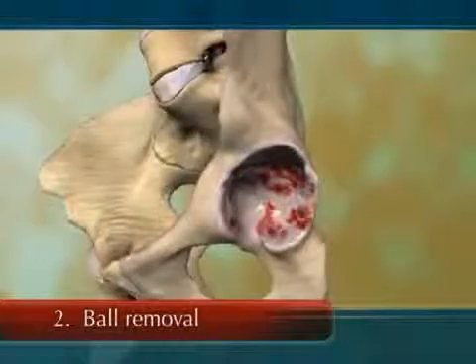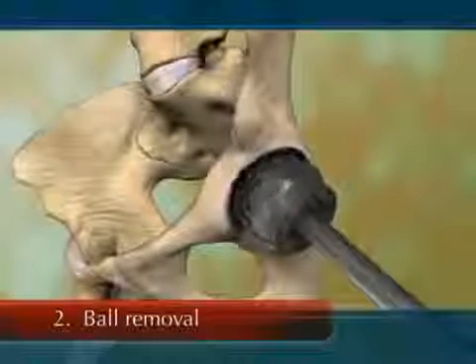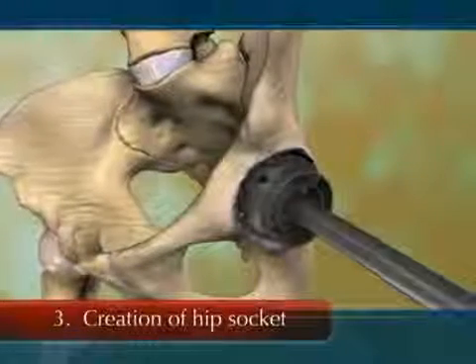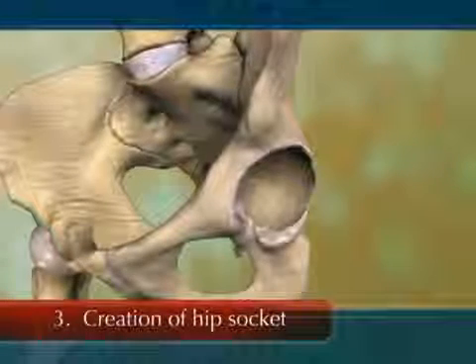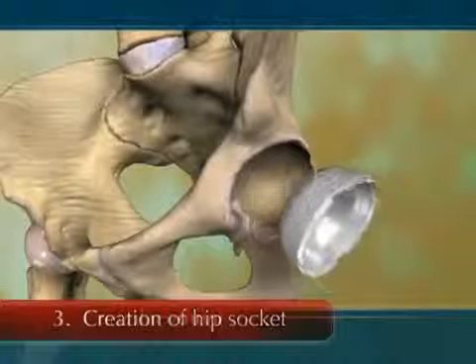After measuring the size of the socket to guide accurate selection, the appropriate reamer, a cheese grater type device, is used to create a perfect hemispherical bone socket that matches the external shape of the acetabular cup. The cup is carefully positioned in the bony socket.